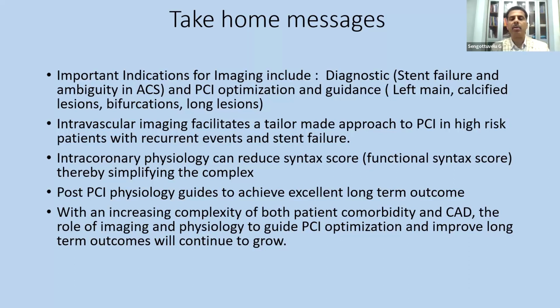We know that the SYNTAX score after using FFR can be brought down by making it a functional SYNTAX score, thereby reducing the number of vessels to be treated. And in patients post-PCI, FFR is again very useful to understand that we have achieved a good result, as well as to give excellent long-term results. So with increasing complexity of both anatomy as well as patient comorbidities, the role of imaging and physiology to guide PCI has become critically important to improve overall long-term outcomes, and will definitely continue to grow.